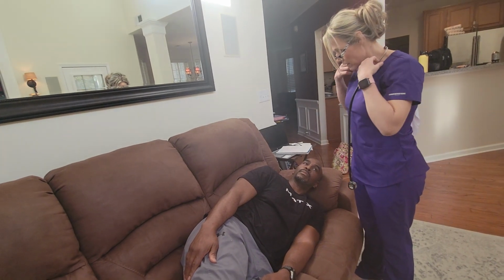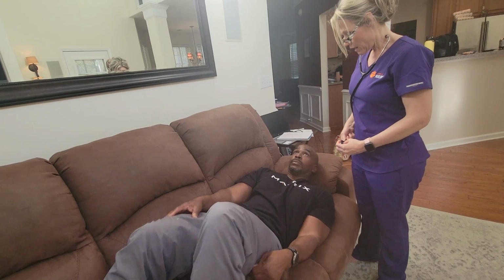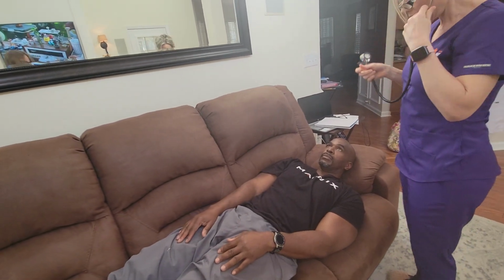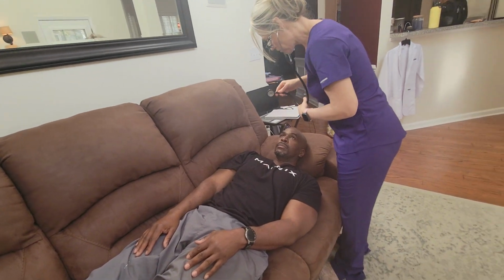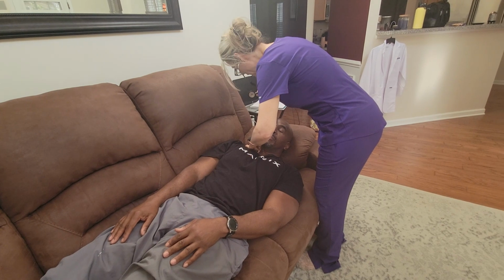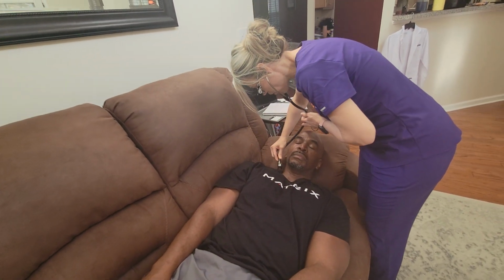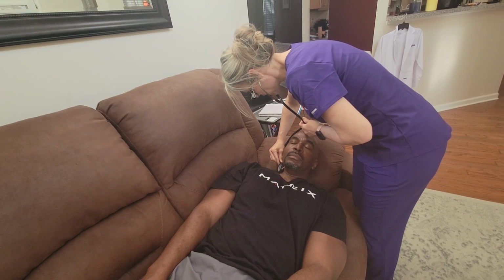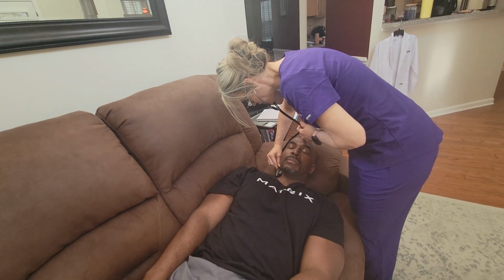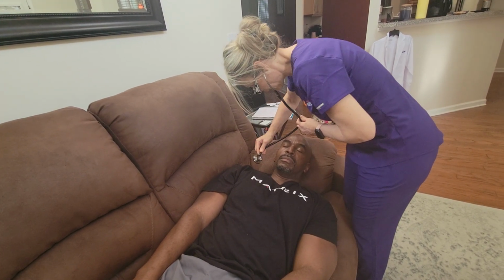So Kenny, I am going to get you to lay back on your back in the supine position, and I'm going to listen to your carotid arteries, and we're going to listen to one at a time. I'm going to first palpate. My hands are cold. And I'm going to listen with the bell of my stethoscope. I'm going to get him to hold his breath. And I'm listening for any swishing sounds, which would indicate a bruit. And I don't hear any.